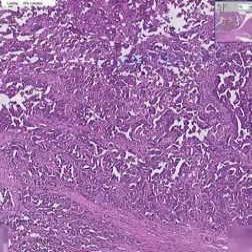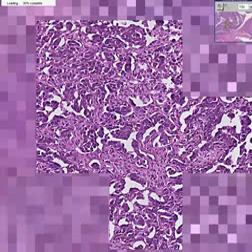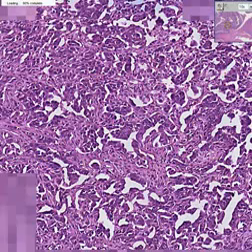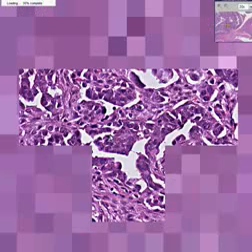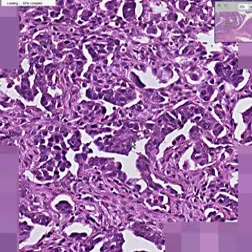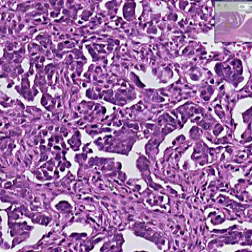And I will also zoom in a little bit to show you all of the classical cytologic features of malignant adenocarcinoma cells as well, in that these cells are dark, big, irregular, lumpy, and last but not least, sort of randomly infiltrative into the fibrous tissue around it.